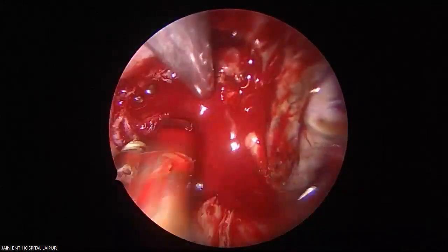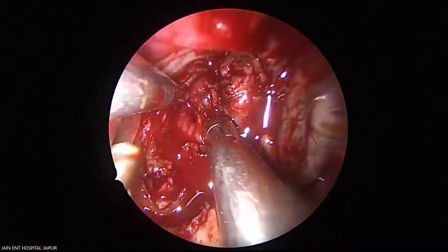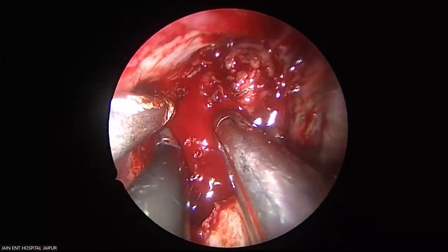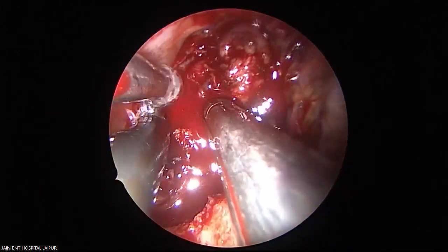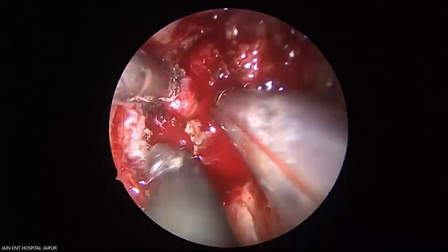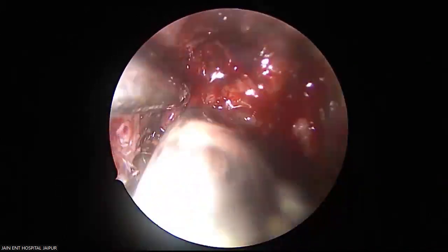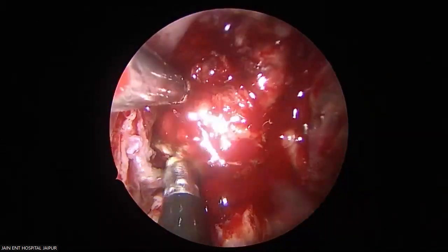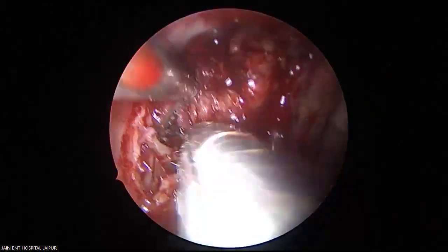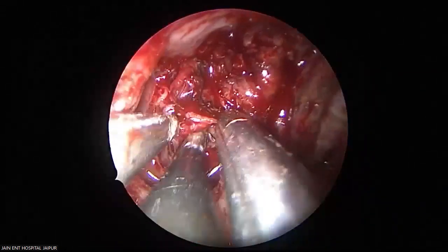Really, this is the vessel. There are n number of branches. Bigger the tumor size, more are the branches. Every branch looks like internal maxillary itself because it is enlarged. So just have patience.